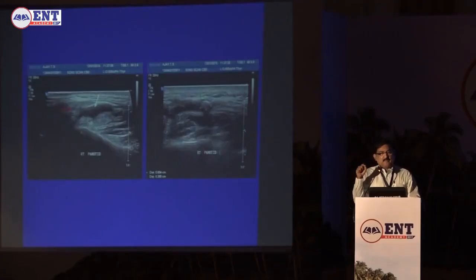Recently I had a patient where there were totally 13 stones and the ultrasound person had counted only some 6 or something. But it's not his fault, it is a limitation of technique.